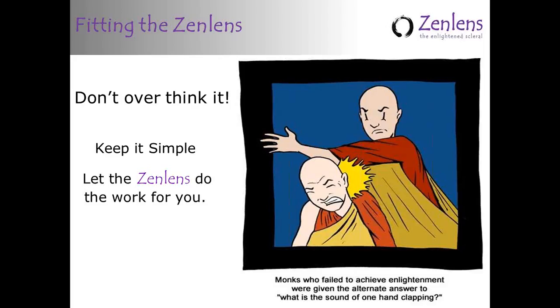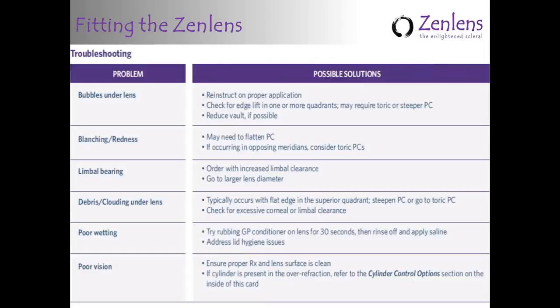Don't overcomplicate things. That last example I showed you was a fairly technical, advanced level of customization of the Zenlens, and the type of thing that keeps me employed. So you use consultation when you have that ability. You can email us, those of you that are overseas, and or call us if that's a convenient option.